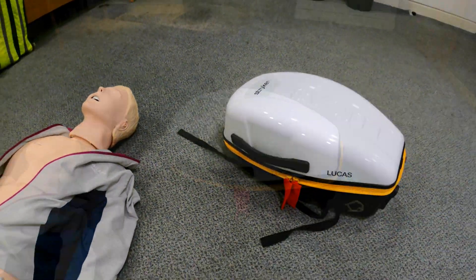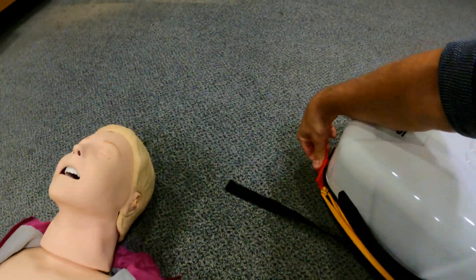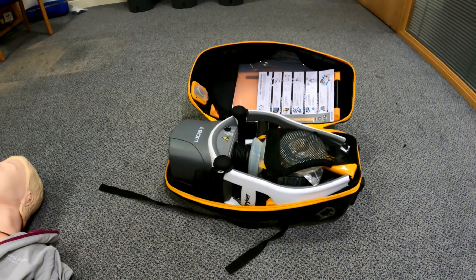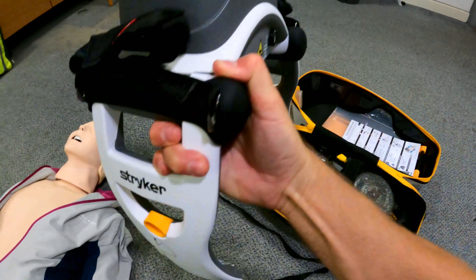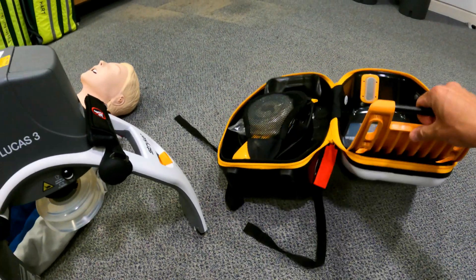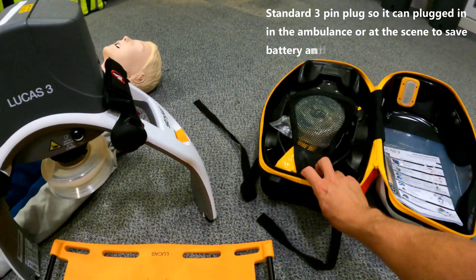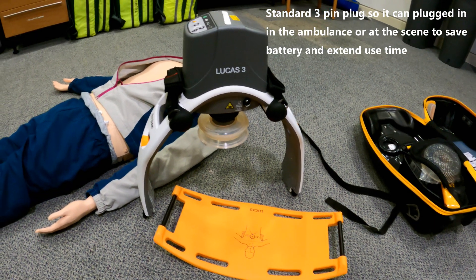If we have a quick look at the actual bit of kit when you open it up — this is how it comes and this is what it looks like. We'll talk through some of the various bits and then apply it so you can see it in action. This is the main unit itself, which we put on the patient. It also comes with a backboard that goes behind the patient, as well as spare batteries and charging cables.